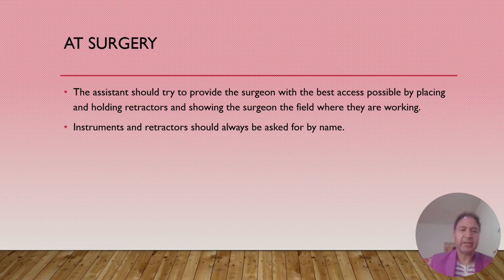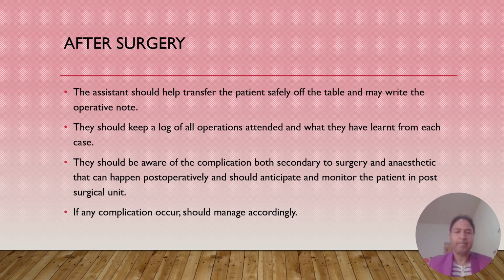Then we have at surgery. The assistant should try to provide the surgeon with the best access possible by placing and holding retractors and showing the surgeon the field where they are working. Instruments and retractors should always be asked for by name. You must remember the names of all the instruments, and ask for the instrument by name and give the instrument by name.